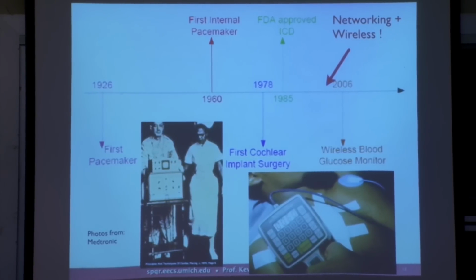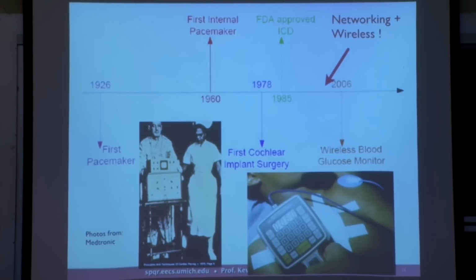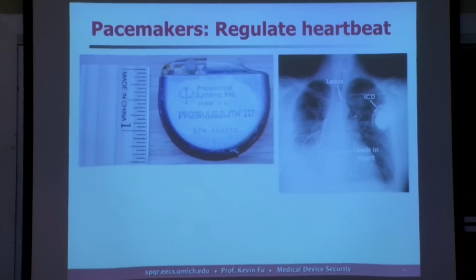But interesting to me as a security researcher was that in around 2003 or so, we began to see defibrillators, such as the one I'm passing around, that started to embrace wireless technologies and networking that you'd be more used to as general computation. And I was thinking, what could possibly go wrong? Luckily, there were a lot of engineers also thinking that same question in companies, but security takes a different mindset, and I'm going to tell you a little bit about how that mindset is changing.